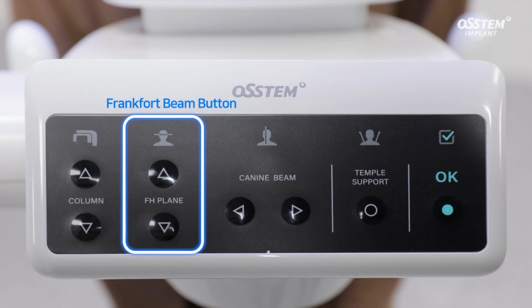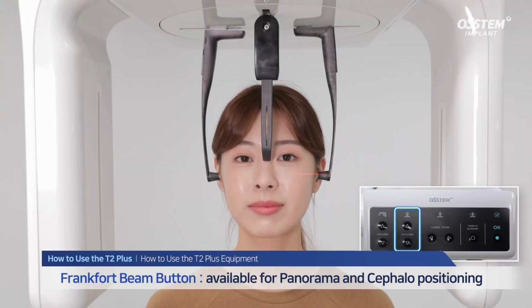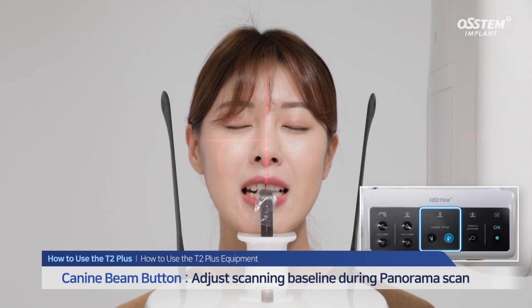Frankfurt beam button. Adjust the position of the beam to the Frankfurt line, which is the baseline for the patient scanning. This is mainly used for panorama and cephalo positioning. Canine beam button. The beam button adjusts the position of the canines, which is the starting point of the panorama scan. Press the button to place it on the canine.